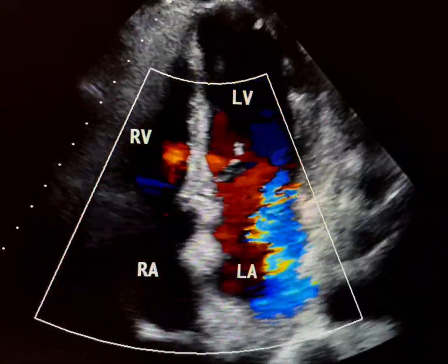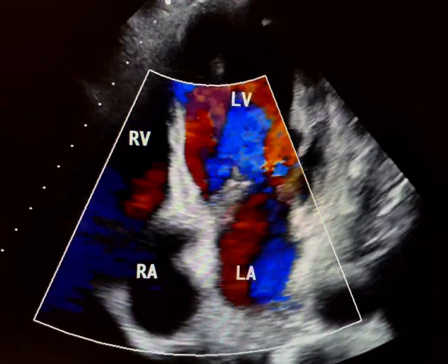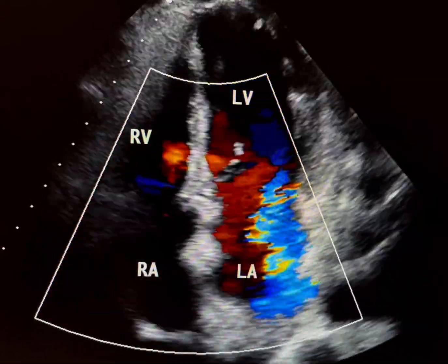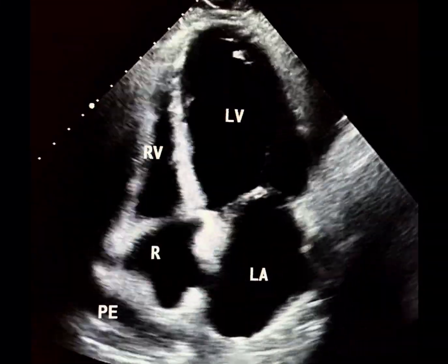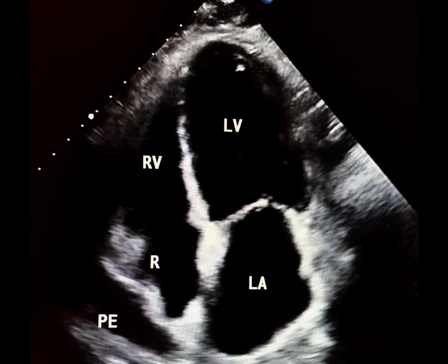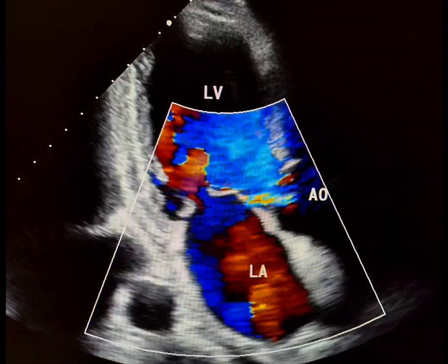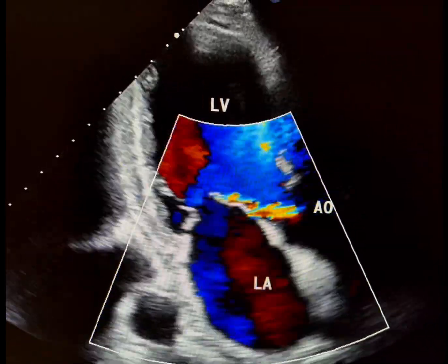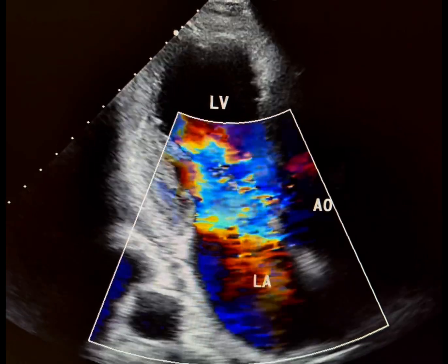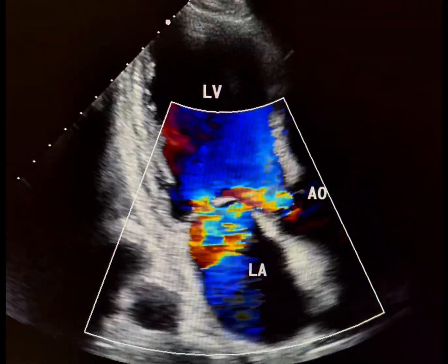This echocardiogram comes from a patient experiencing exacerbated dyspnea where severe mitral regurgitation (MR) is clearly seen. Before considering mitral valve surgery, it's crucial to identify the underlying cause of the MR. Sometimes, significant MR occurs even when the mitral valve itself is structurally normal. This type of MR is known as secondary or functional MR.